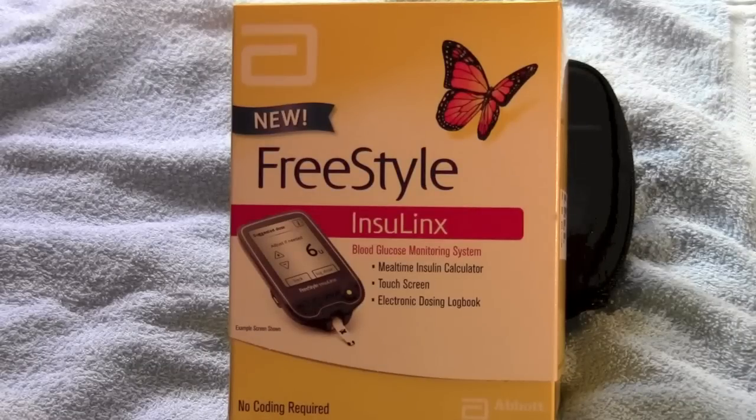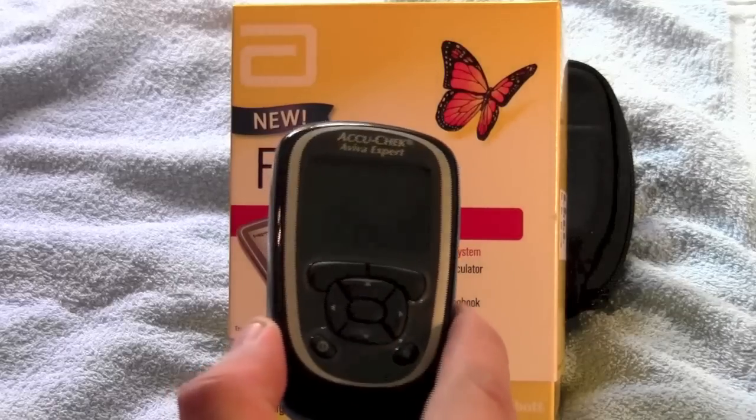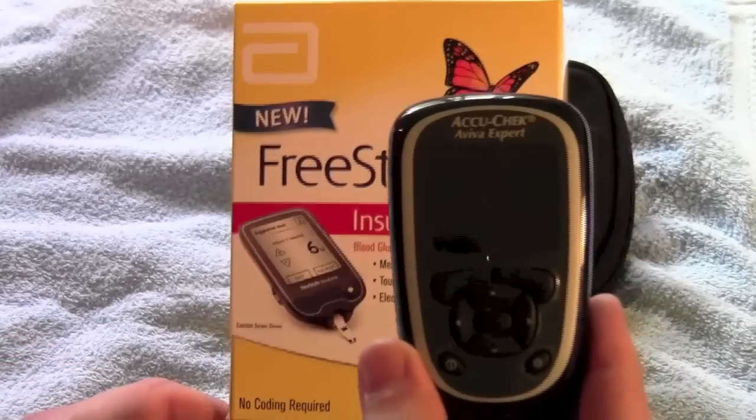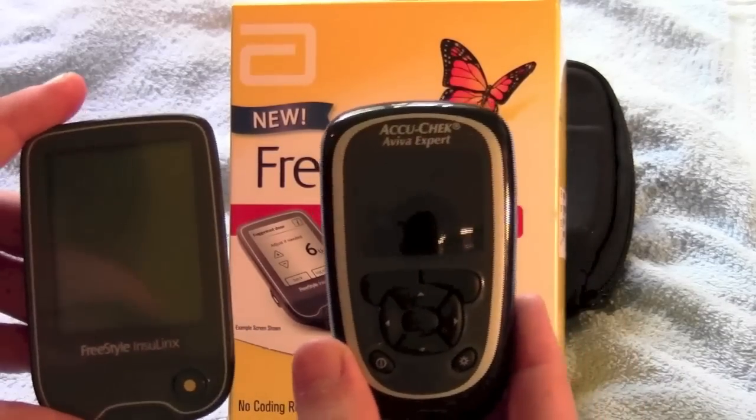Hello everybody. A couple of days ago in the post, I received my new Freestyle Insulinx blood glucose meter, so I thought I'd make a small video on that. I don't really intend it to be a full unboxing and review of the Insulinx, because I think there's plenty of those on the internet already. But because I already own the AccuCheck Aviva Expert, I thought I would take a look at the two side-by-side and discuss some of the pros and cons of both meters.